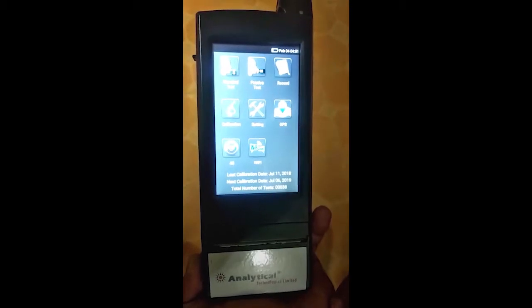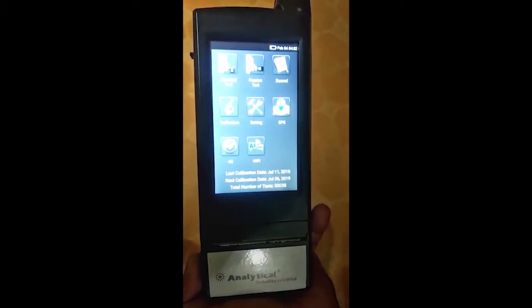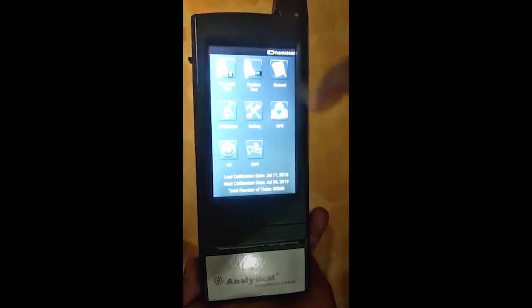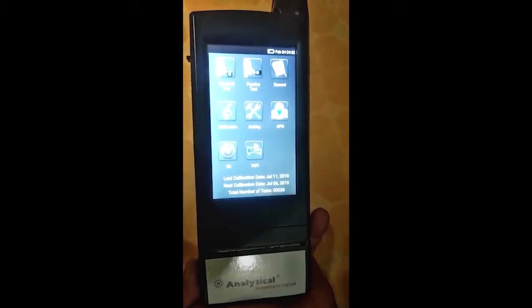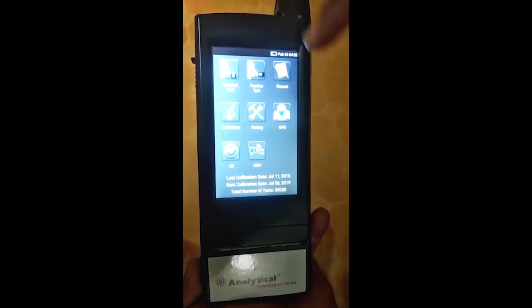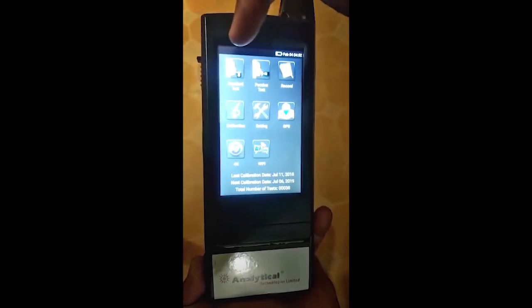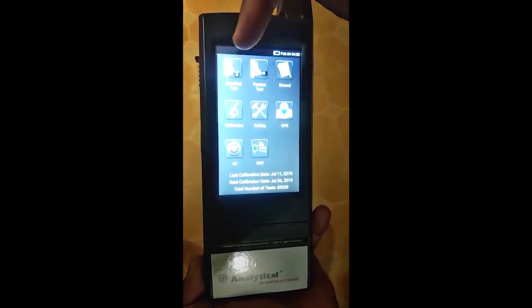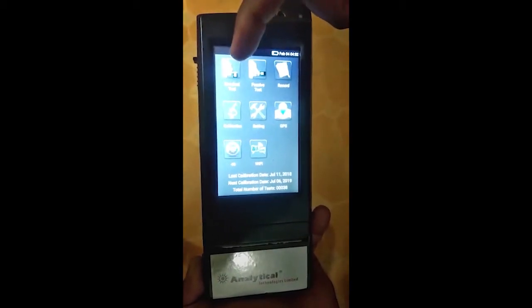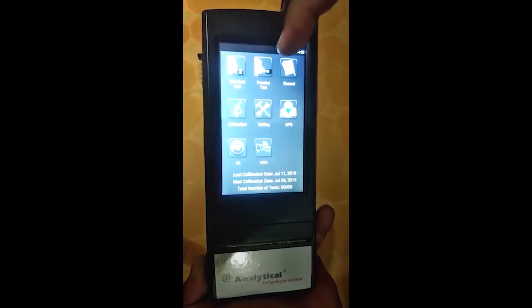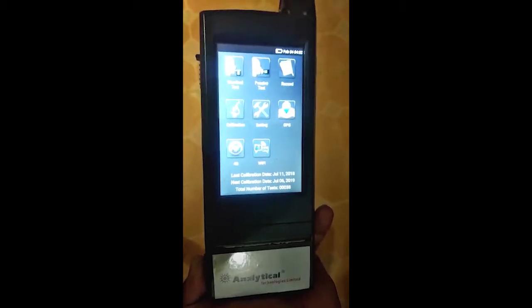Welcome to Analytical Technology Center. This is the alcohol analyzer. In this we have two different tests: one is the standard test and one is the passive test.